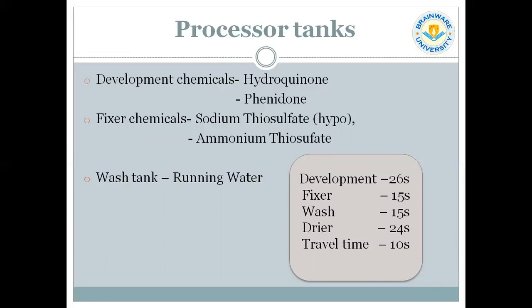So as you can see, the total processing time is much less than the manual film processing system, and that will increase the workload capacity of any hospital.